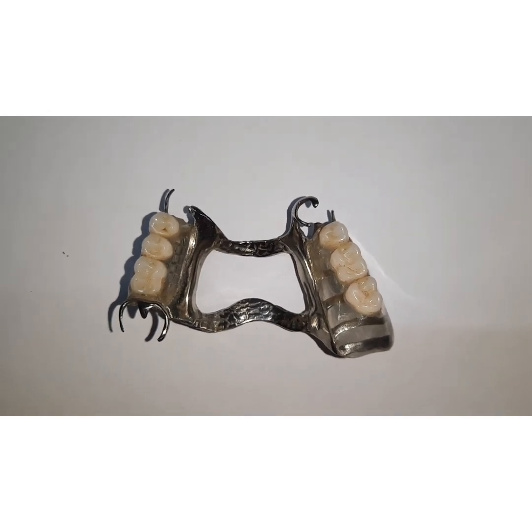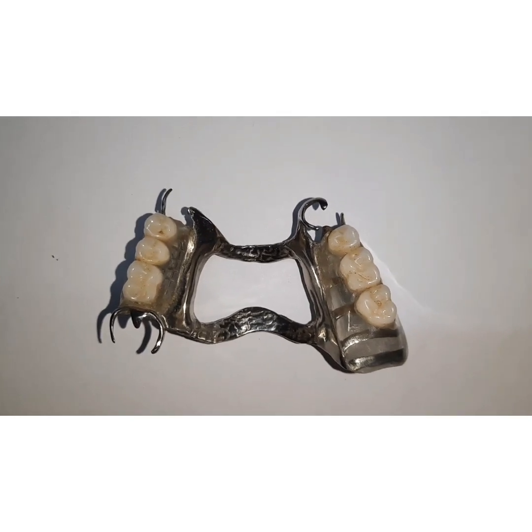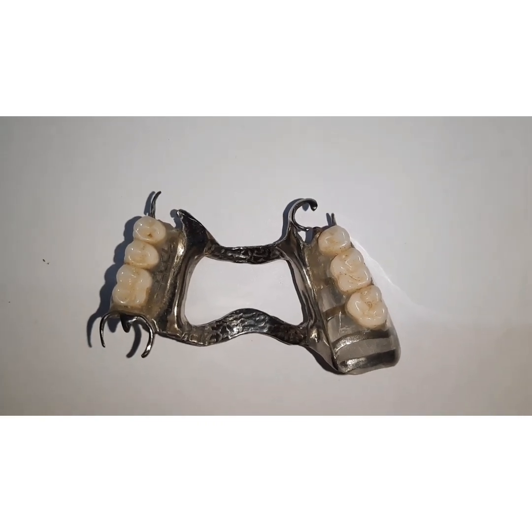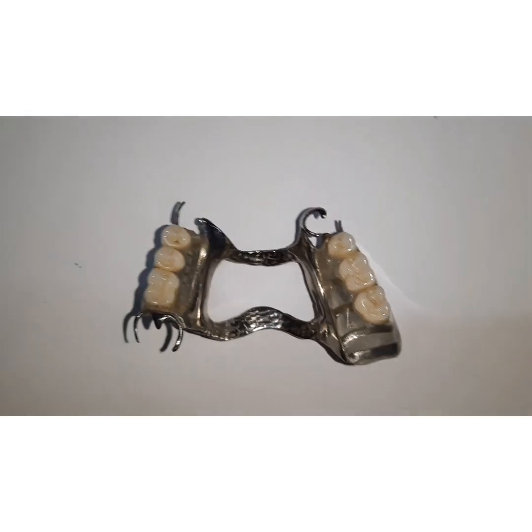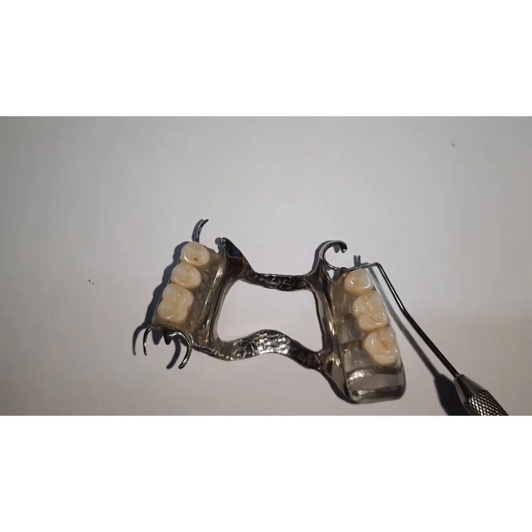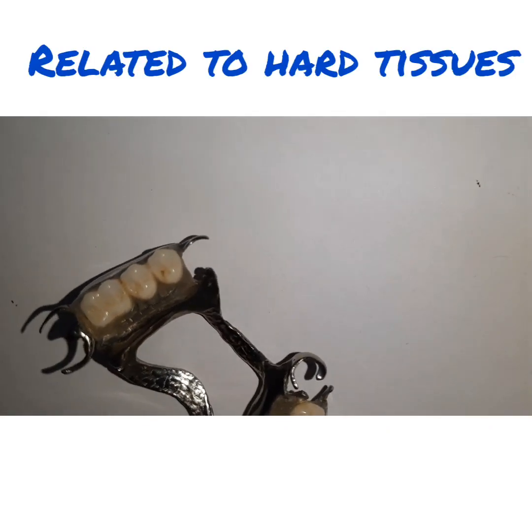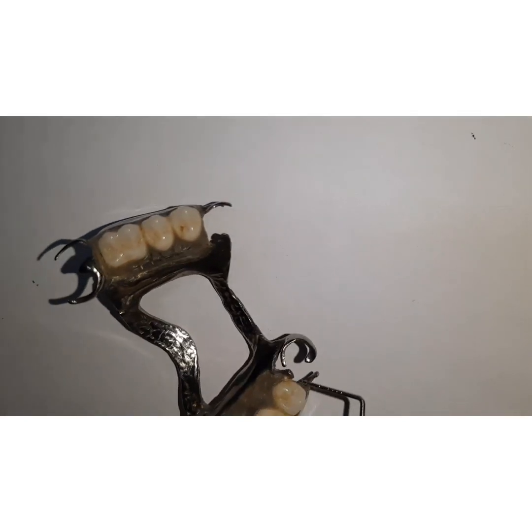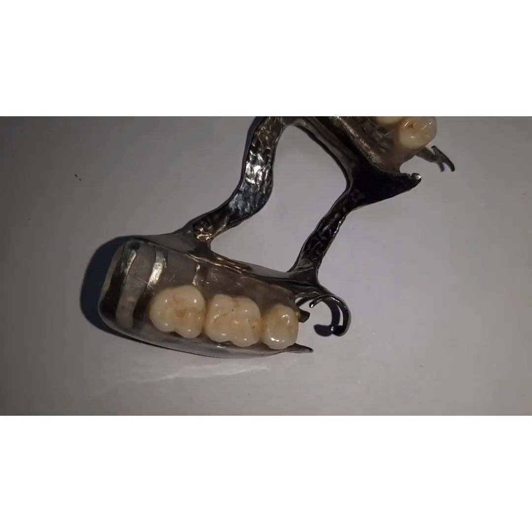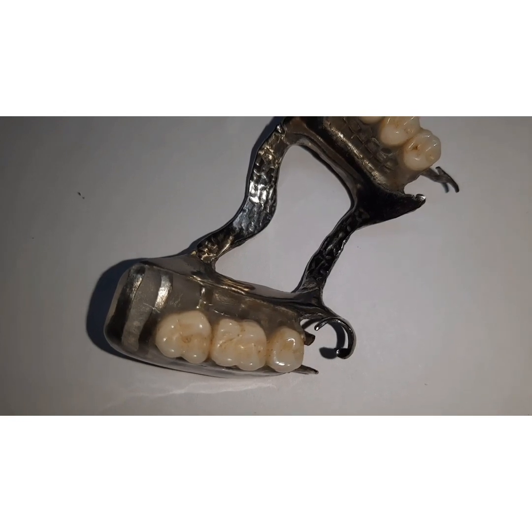Any interference in either of it, you need to identify that and remove that particular premature contact. Or if there is any excess of resin in between the framework, that could be also in the proximal plate or in between this proximal plate and the partial denture, that is the acrylic denture. So any excess of that material is trimmed off with a high speed bur. Once you have reduced that, then again place the denture and check for the comfort.